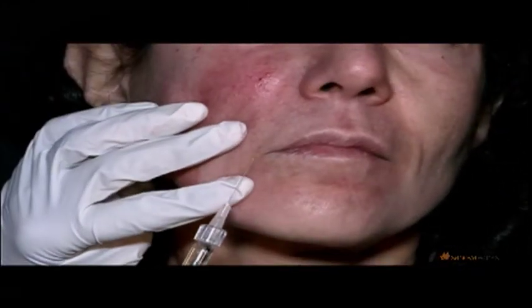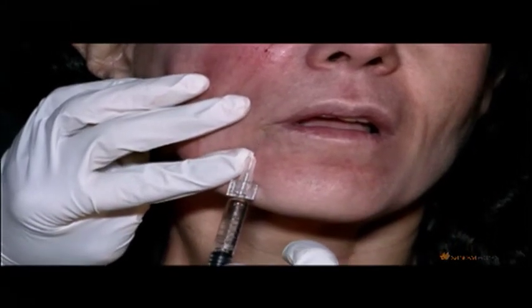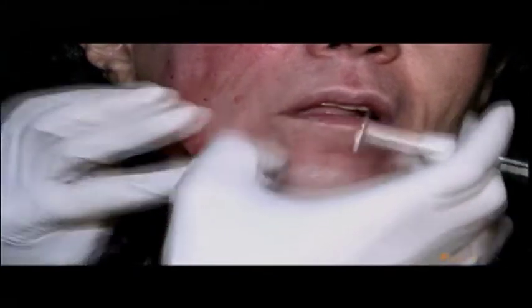So we can raise the corners of the mouth a little bit. Just open your mouth, Katya. Katya shared with me that she doesn't really want to have a lot of lip augmentation, maybe just a little bit of definition of the lip.